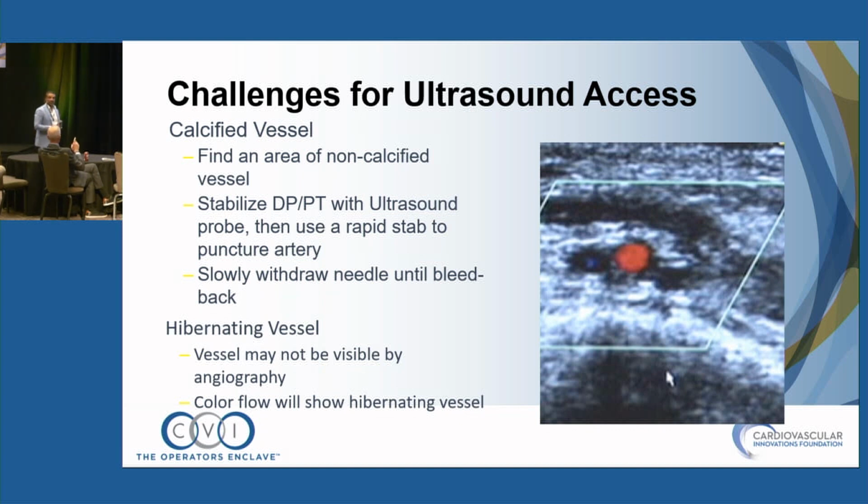Yes, sir. Real quick. Do you prefer a transverse view of the vessel as opposed to a longitudinal view when you're putting your needle? Yeah, so that's exactly right. In the femoral, I like the long axis view. In the pedal access, I like the short axis because of those veins that sit right next to it. Sometimes it is so close that it's kind of hard to get access there.